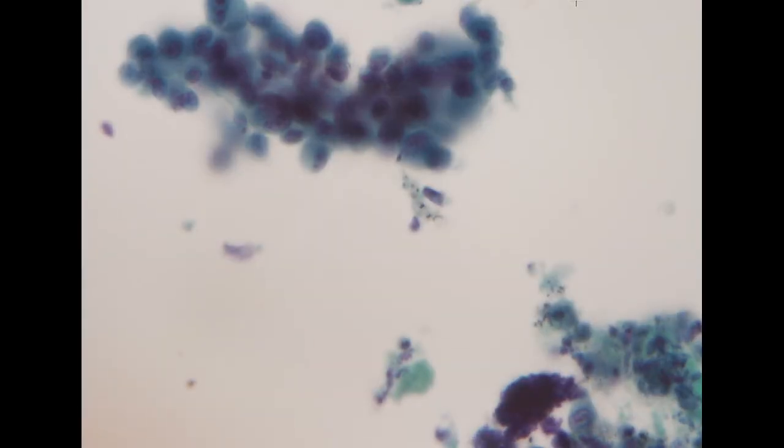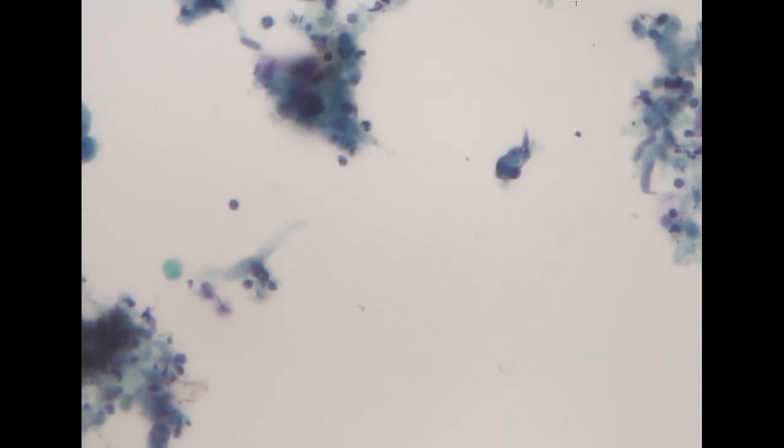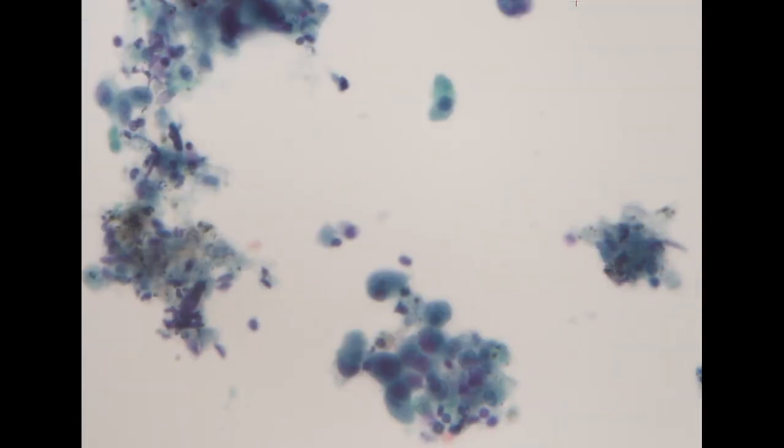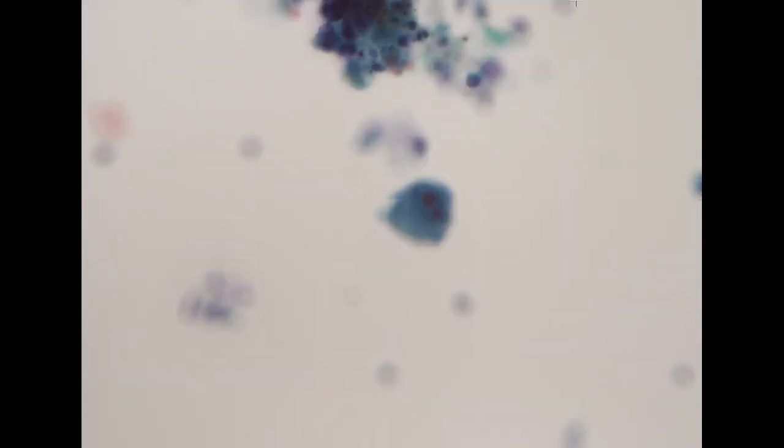Because you can tell by the morphology, this is way too polymorphic. It's almost what we would call this anaplastic feature, and with a very massive necrotic background. So for this case, we actually suspect that it is an undifferentiated carcinoma.